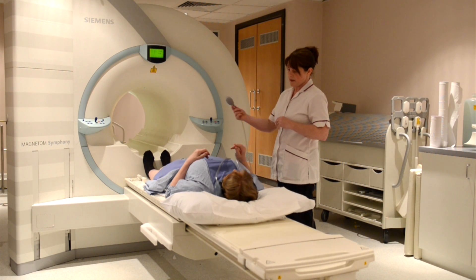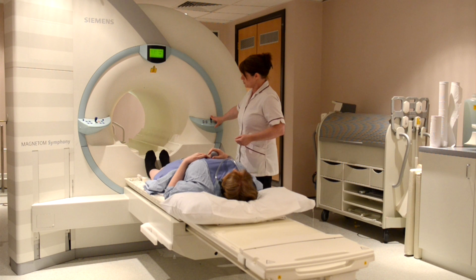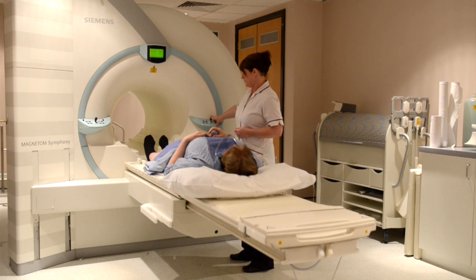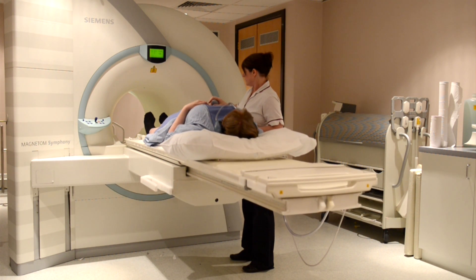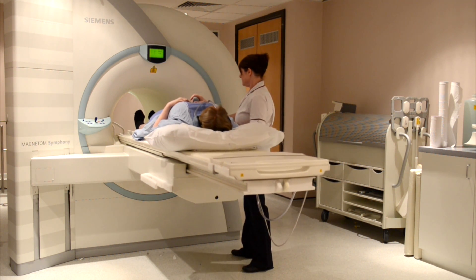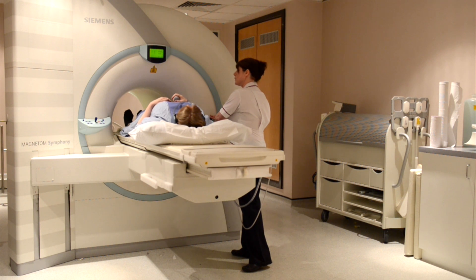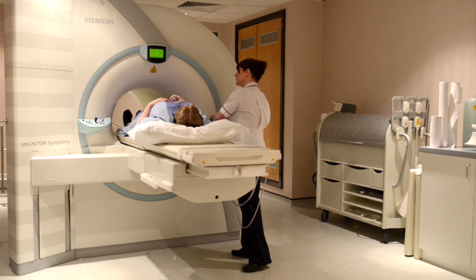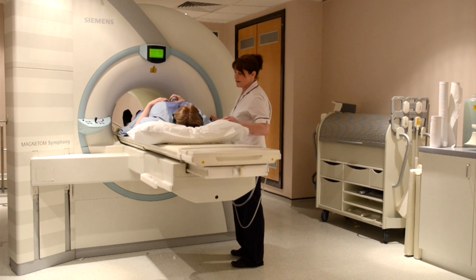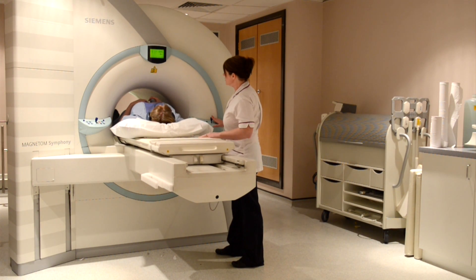The scan necessary for this procedure is a Magnetic Resonance Scan, or MRI. It is a painless and safe scan using a magnet to give a detailed image of your knee and further images of your hip and ankle. The scan takes about one hour and requires no needles. Although the space in the scanner can feel tight, you enter feet first and your head and shoulders are not in the scanner. Staff are on hand to ensure you are as comfortable as possible.